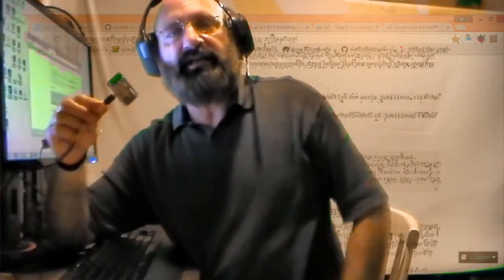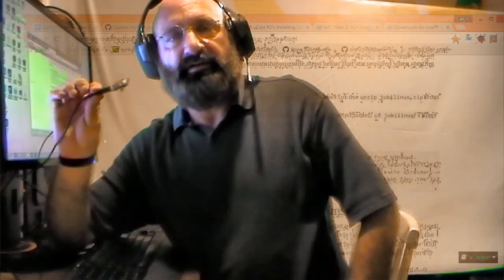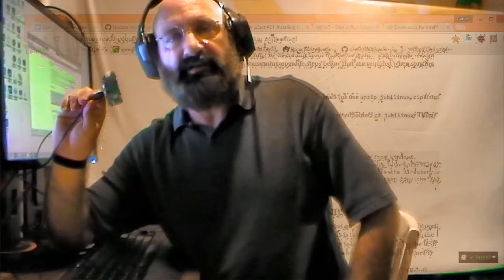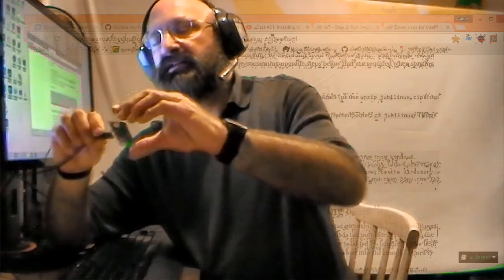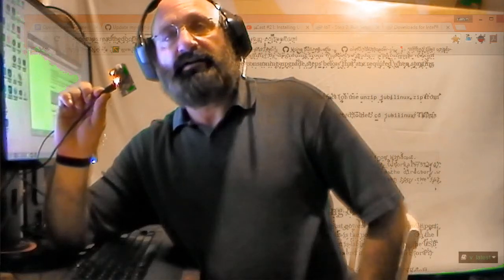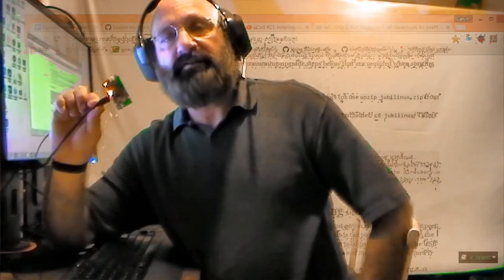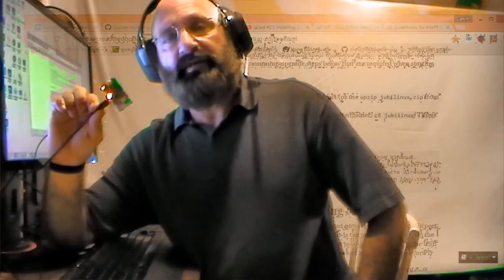Okay, so I just plugged that in. The cord was already plugged into the computer that I'm using to get my files and all that. Oops, the light's not on anymore. Okay, I didn't have a good connection. It's not a problem, don't worry about it. I didn't break the board. Don't worry about making mistakes.